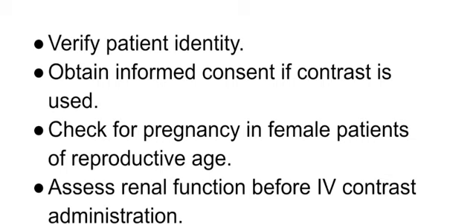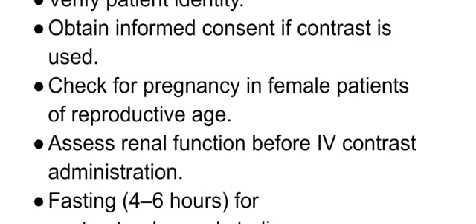We also include the name of the contrast, the type of the contrast, and explain the patient's condition and the study which will be performed, by the radiologist or radiographer present at the station, who will inform both the patient and their attendants about all the details. Next, you have to check for pregnancy in the case of female patients of reproductive age. If they are above the age of 18, it is compulsory to note their LMP, that is, the last menstrual period, when they last had their menses.